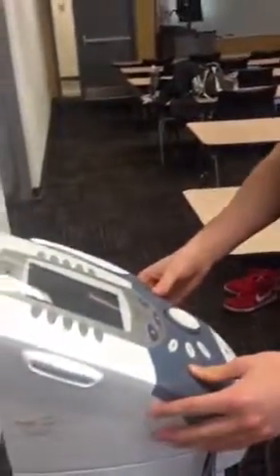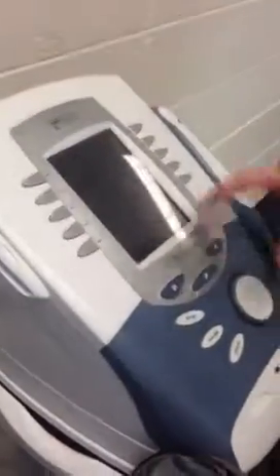Second thing you do during this treatment is go over to the machine. You want to make sure that it's off, no one's using it. You want to check the machine for abnormalities, any cracks in the glass, or any wires sticking out of the machine, as well as looking at the outlet, making sure the plug is fully plugged in and no wires are frayed down there.